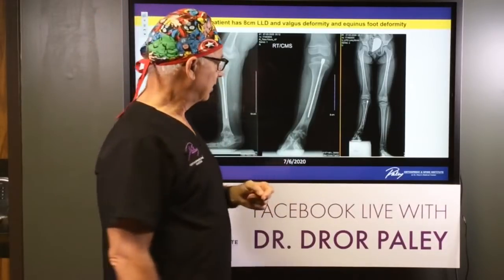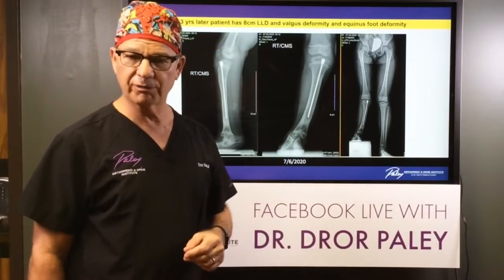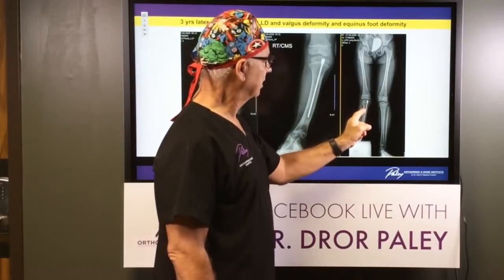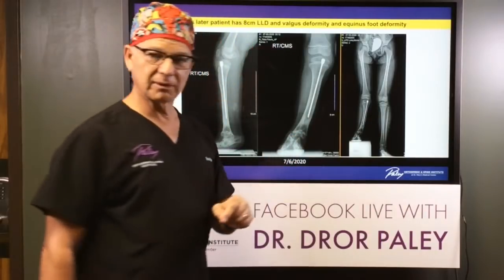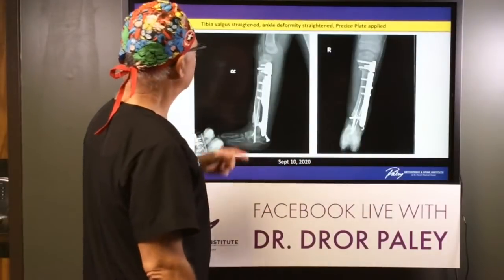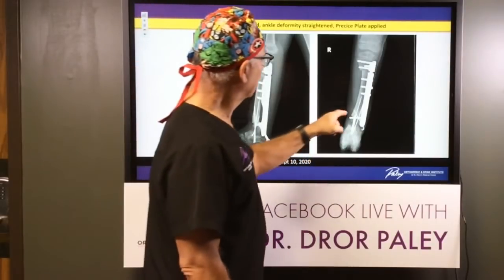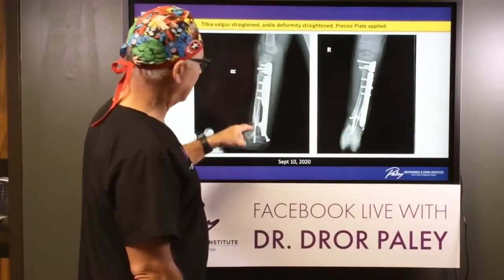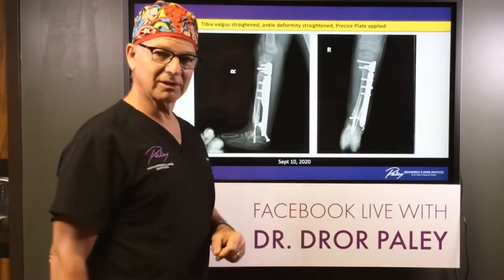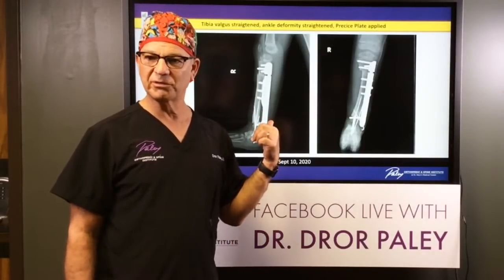She's had no problems. She's had no pain. Her dad's been interviewed. I'm comparing because they have the ability to compare the external fixator to the plate. And for them, it's like night and day. No pain. This girl is just in and out of the hospital in a day or two. She's had really no issues, no complications, and she's walking around. She's weight bearing with this on. So she's been doing physical therapy, coming for follow-up, and obviously we're not finished with the treatment, because it's only really a month and a half since we started.